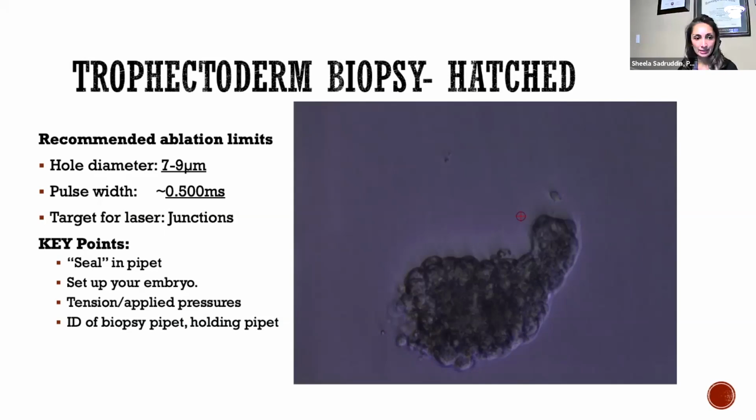The tension that you apply to the stretching away of the cells, you certainly want to make sure that one of the main things to focus on in the biopsy procedure is to make sure that you have a usable embryo. So instead of focusing mainly on the biopsy, you want to make sure that you focus on making sure that your embryo itself is healthy and it's doing well. So just keep that part in mind.